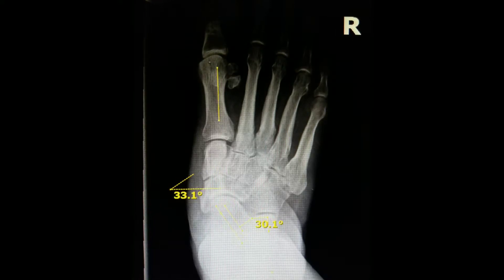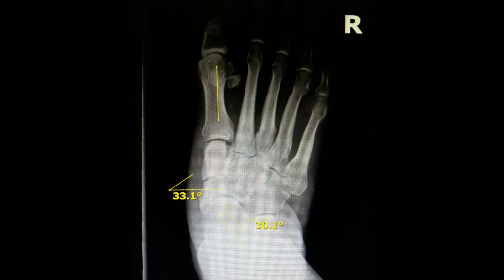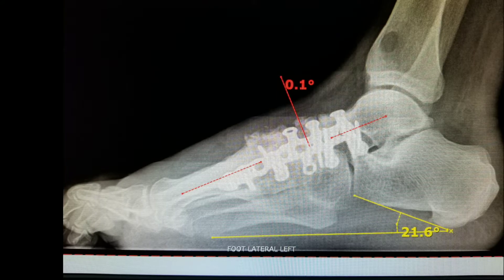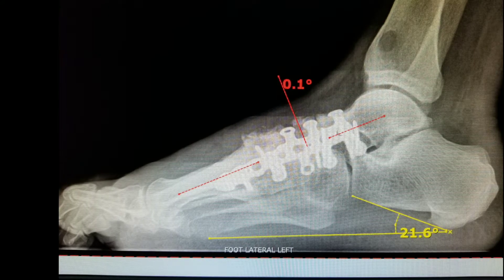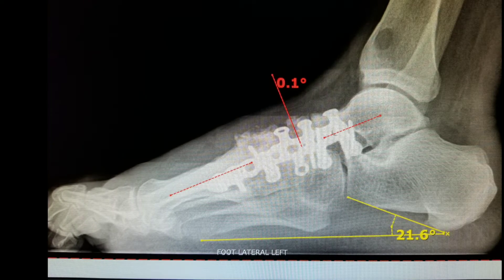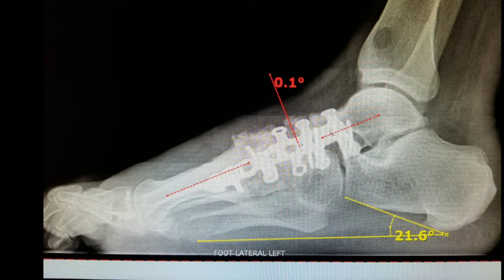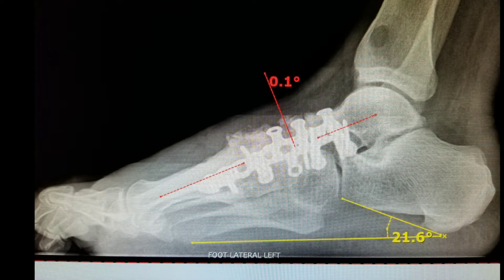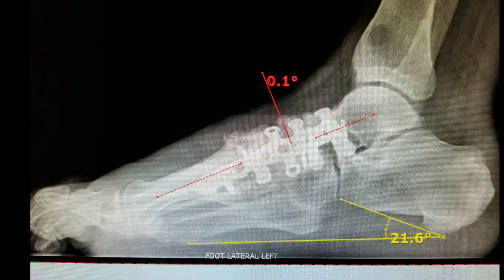One of the workhorse procedures that are performed is the medial column fusion. Here, you can see the realignment of that 19 degree angle to a 0.1 degree angle and back to a norm of 21.6 in the calcaneal inclination angle. These angles must be completely corrected in order to have a successful surgery.